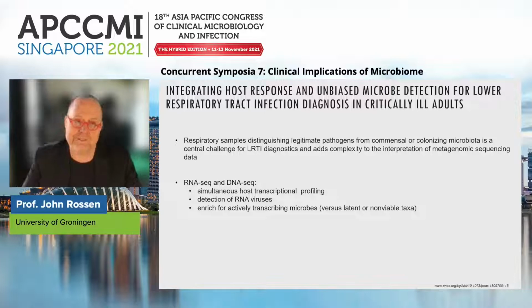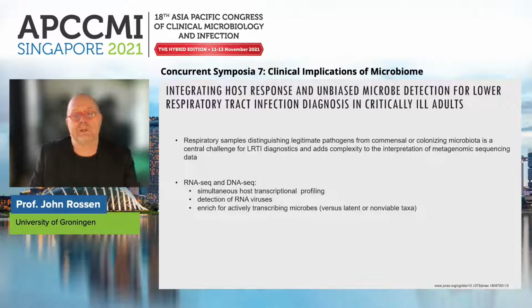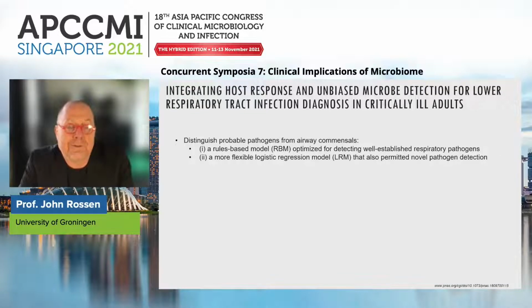This allows, as I told you, simultaneous host transcriptional profiling, but also detection of RNA pathogens like RNA viruses. And also, interestingly, it enriches for actively transcribing microbes versus the ones that are latent or non-viable anymore, because in that case, you will only detect the DNA.